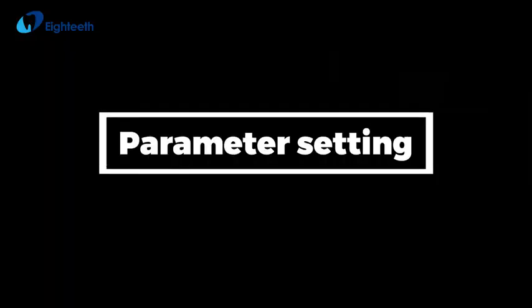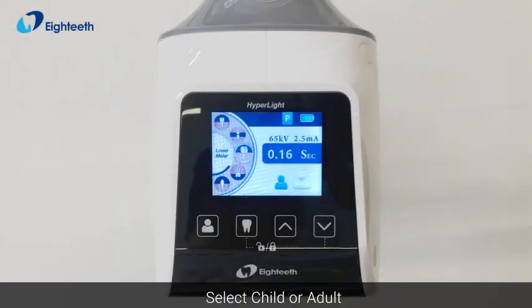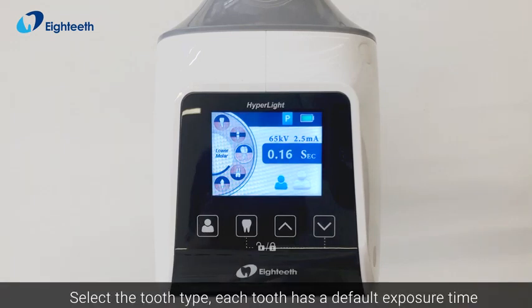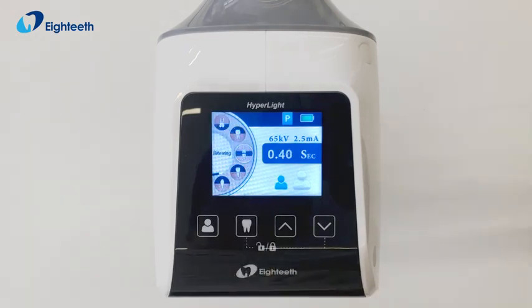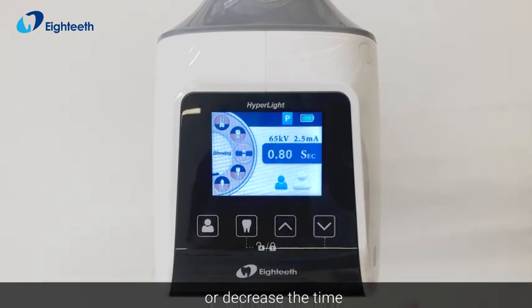Parameter setting: select child or adult, then select the tooth type. Each tooth has a default exposure time. You can set the exposure time by increasing or decreasing it as needed.